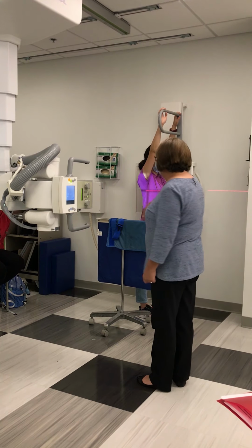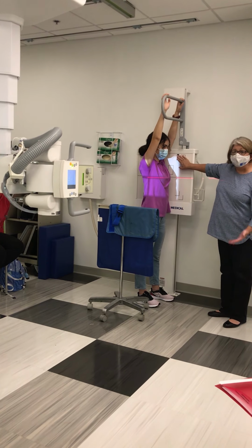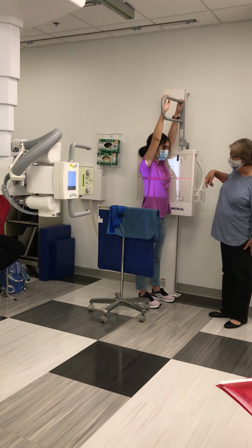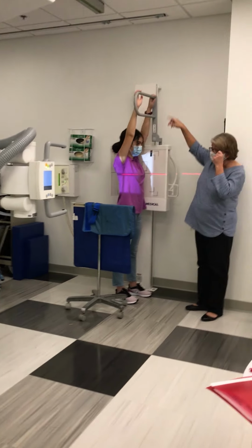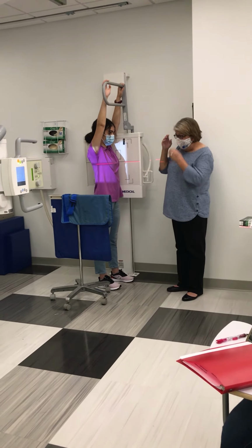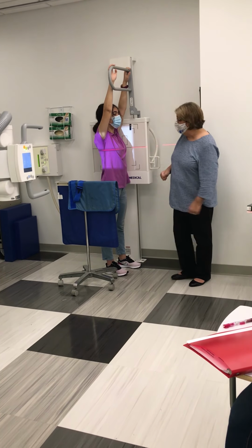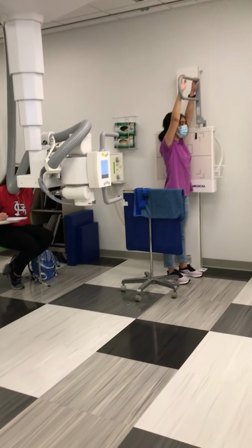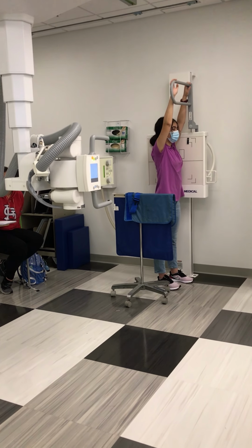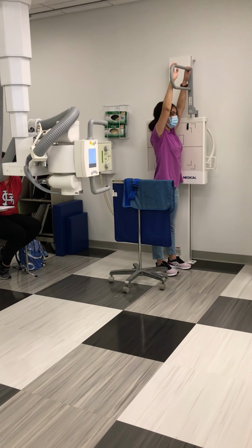I've provided shielding. My marker is placed superiorly. I've used my left marker because the patient's left side is against the bucky. Her arms are reached up to the highest bar so that there's no soft tissue of the arms obscuring the apices. I'm going to ask you to raise your chin, and I'm going to give you some breathing instructions. Taking a deep breath, blow it all the way out. Taking another deep breath and hold it, exposure. You may breathe and relax.